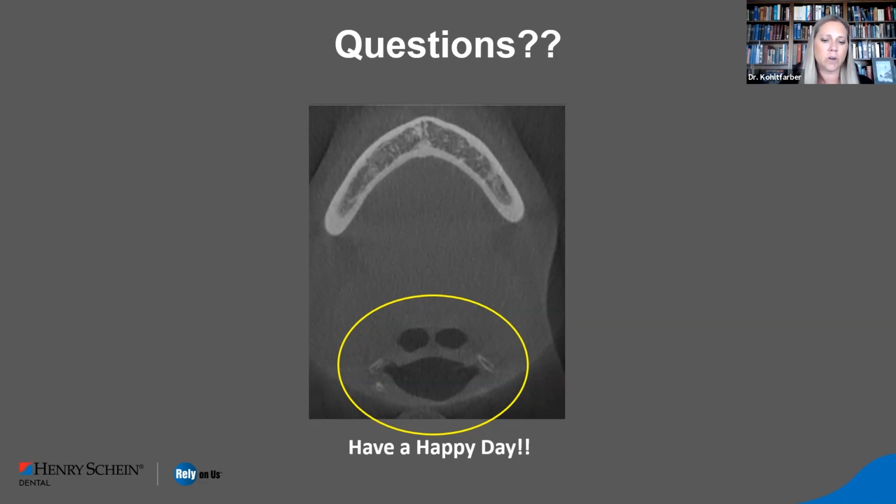And so as far as the American Academy of Oral and Maxillofacial Radiology has gone, they've been really careful with that type of terminology. If it becomes standard of care, it will be pressed from the legal arena. And that's what we are seeing. We're seeing this kind of stuff coming down from the legal arena. They're doing some of the same things we saw happen with medical CT. We're following that pathway with CBCT, because now, if the lawyer says, well, hey, they didn't have a cone-beam CT and it's readily available and they could have had it and it maybe would have saved the patient all this pain, that's what we're seeing happen. So if it becomes the actual terminology, it will be pushed from the legal arena.